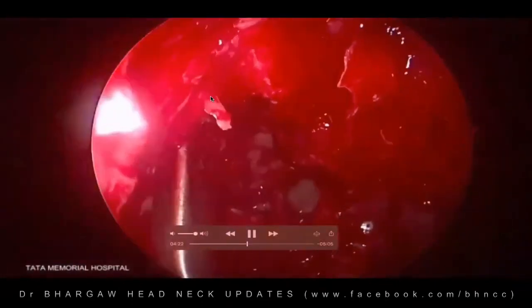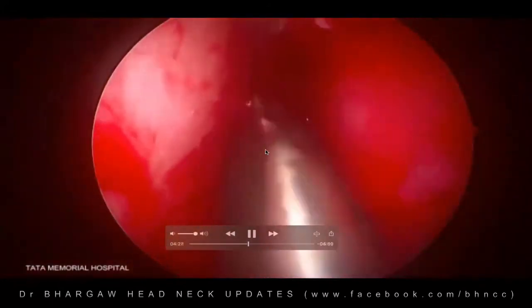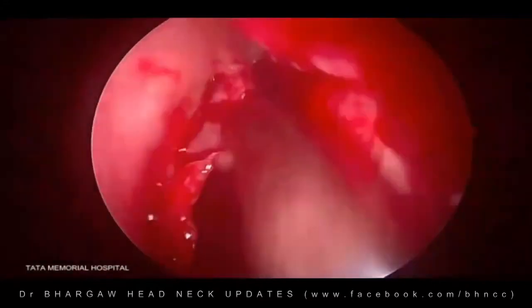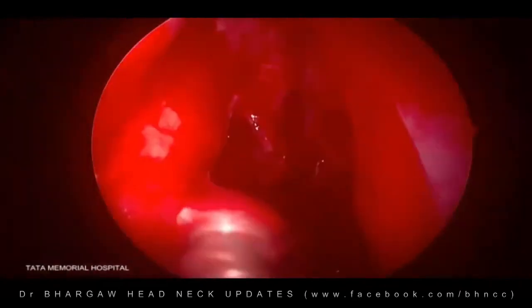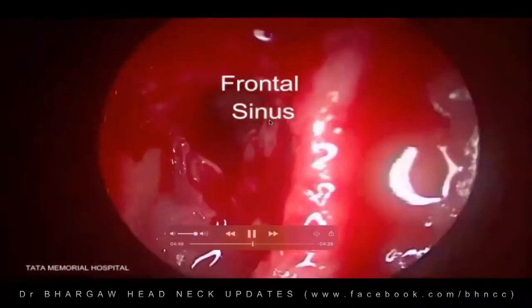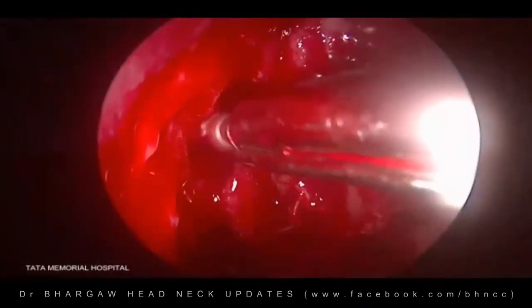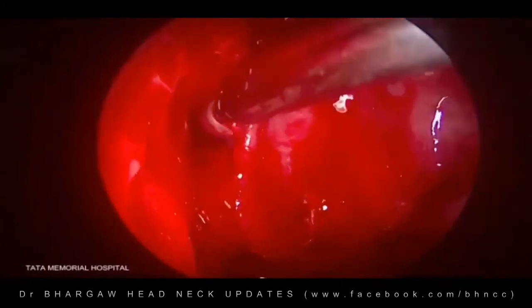Now once that is done, the posterior extent is done. The sphenoid sinus is seen. Now we are trying to look at the frontal recess. I'm just trying to remove the mucosa at the frontal process, similar to the Draf-style mucosal flap, but in this case it didn't make a flap. I removed that mucosa to make the access better. You see the frontal sinus well. Now you need to widen this frontal recess much more than this, and similarly on the other side, so that the entire modified Lothrop, Draf 3 procedure can be done.